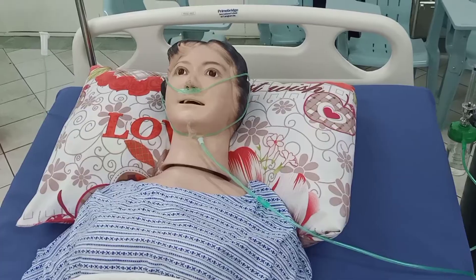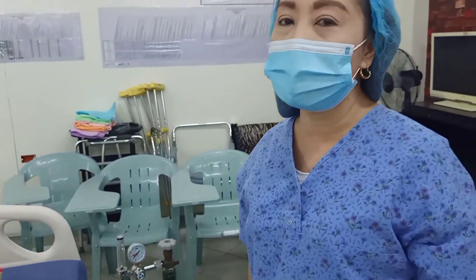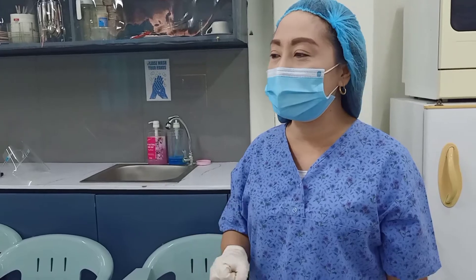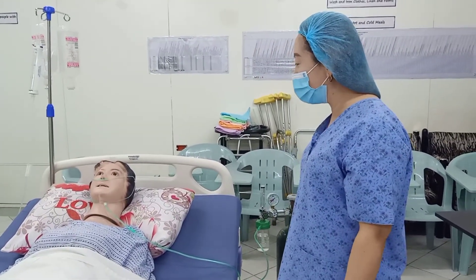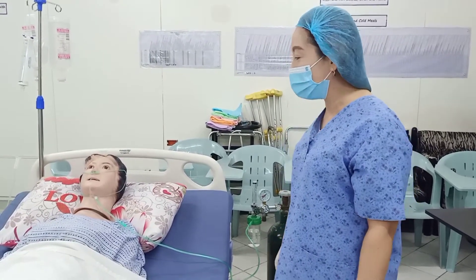The patient is now receiving oxygenation. That is how you administer oxygenation to your patient. Now I'm going to show you how to remove the oxygen cannula after administration. Knock on the door three times for the patient's courtesy, open the door, and greet the patient. I am Aurora and Cruz, your caregiver for today, and it is time to remove your cannula as per the doctor's order.